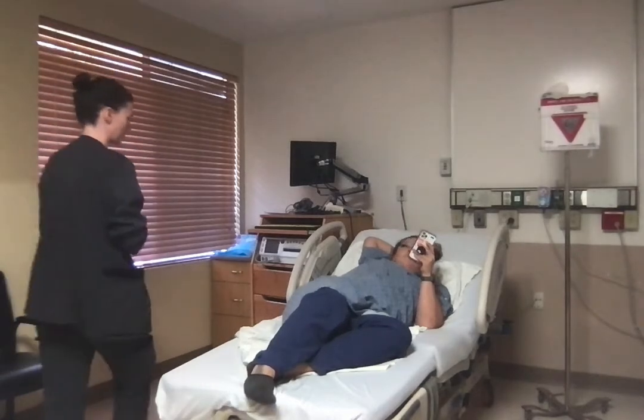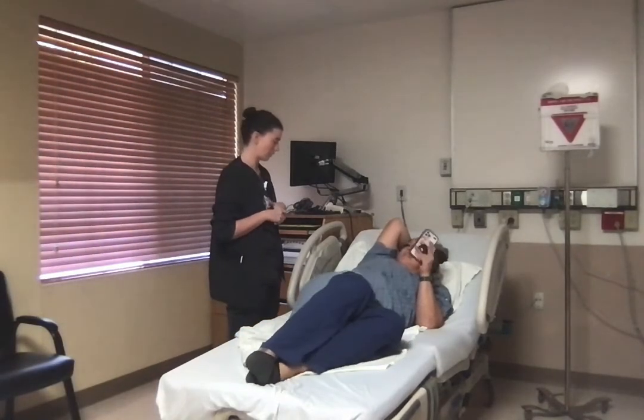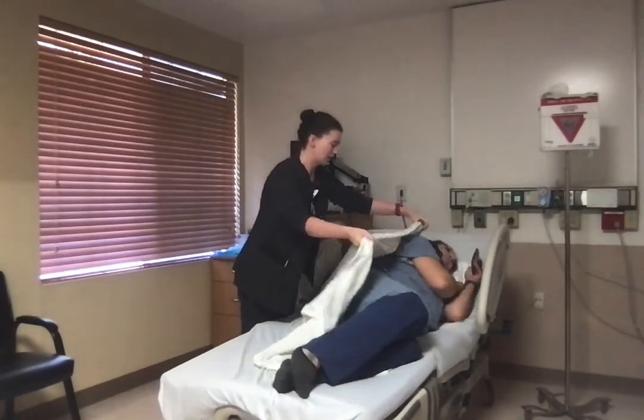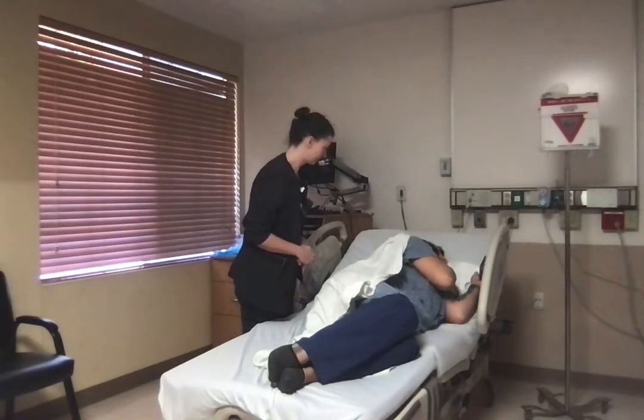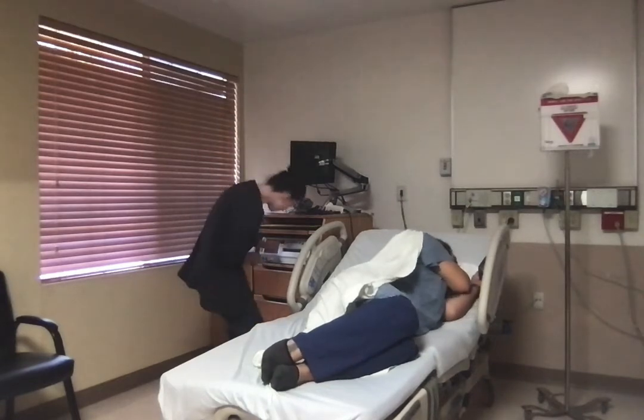Hi, Mom. I just wanted to let you know that it looks like baby's looking a little sleepy since we took the pillow out, so I'm going to help position you back up on your left side. Okay. And this should help just keep baby's heart rate where we need it during labor, okay? Okay, that's fine, as long as he's okay. Whatever works.